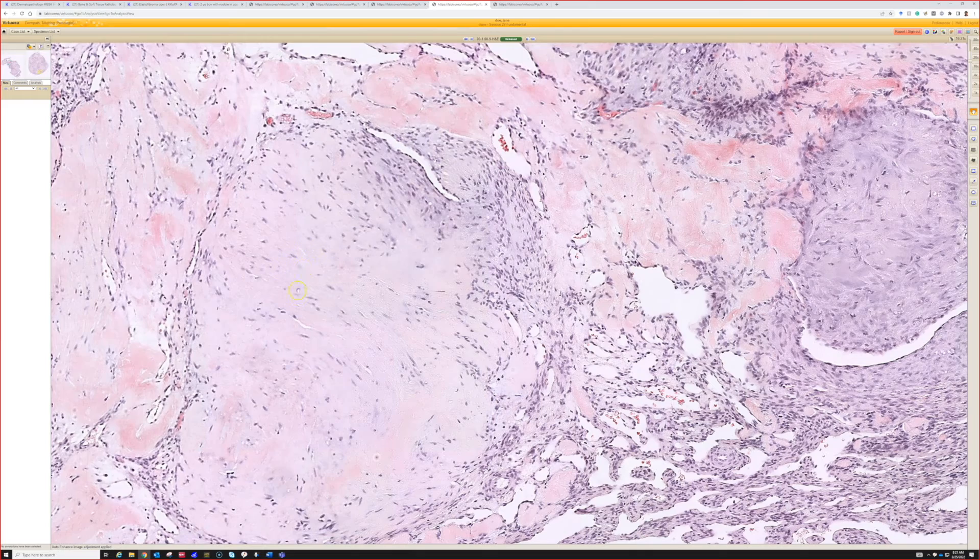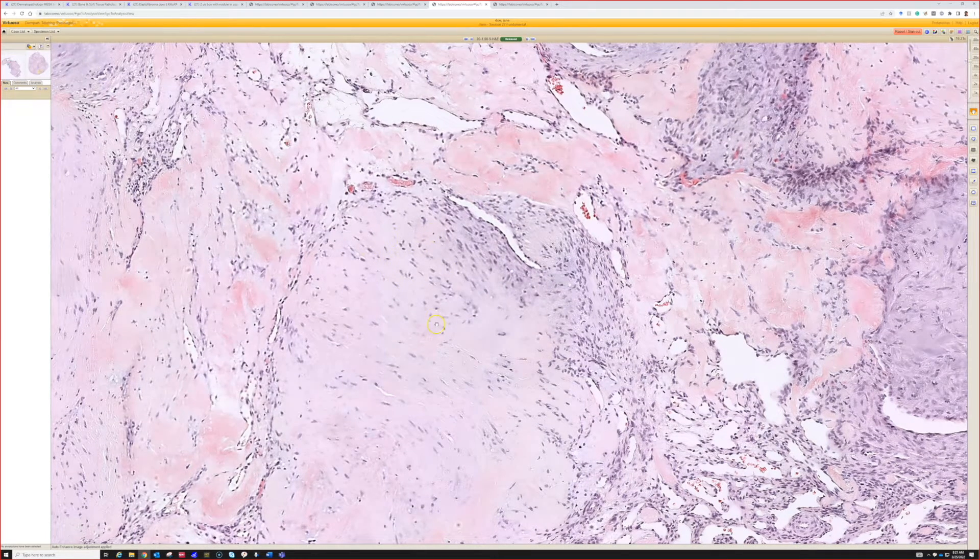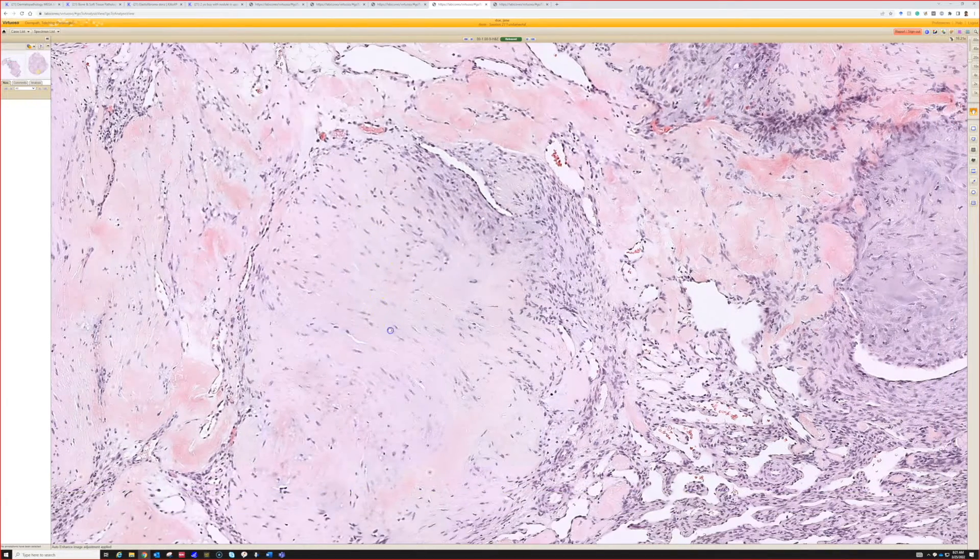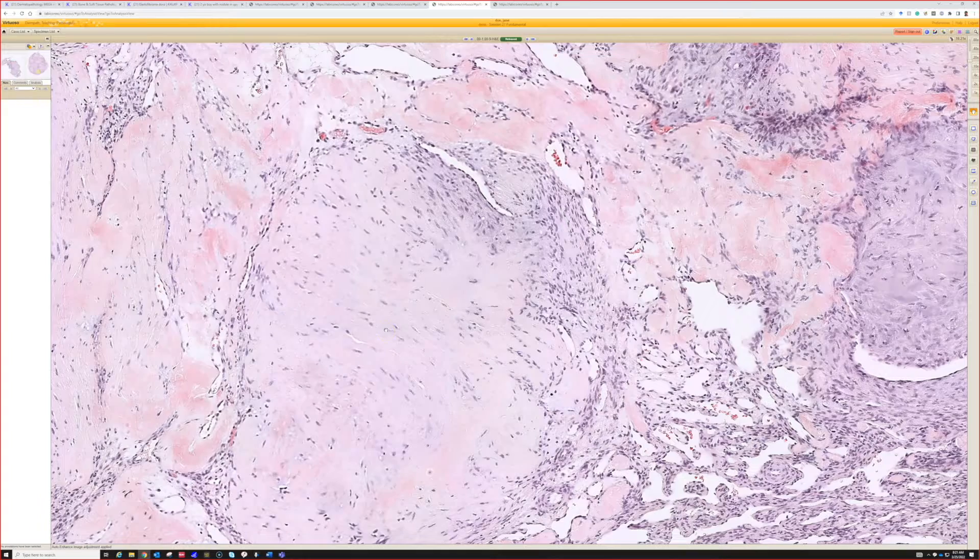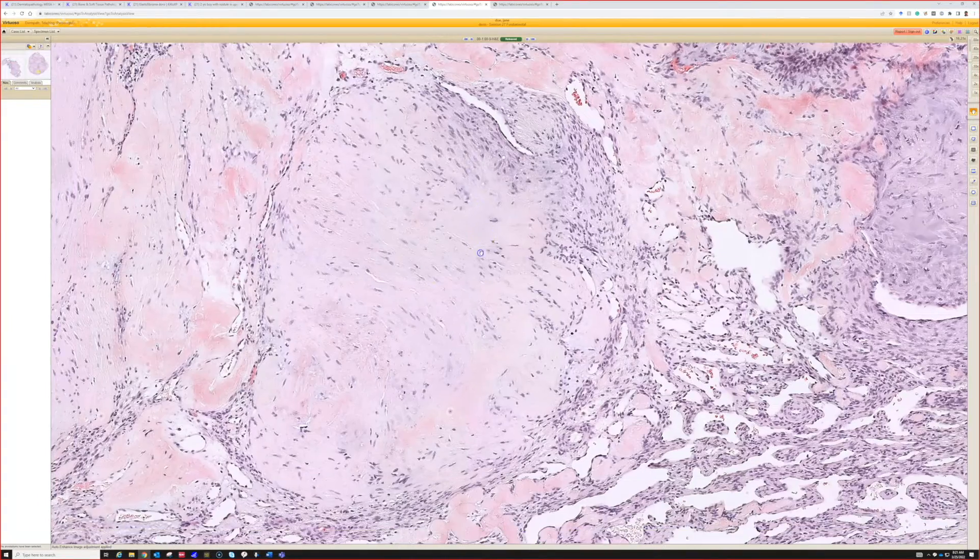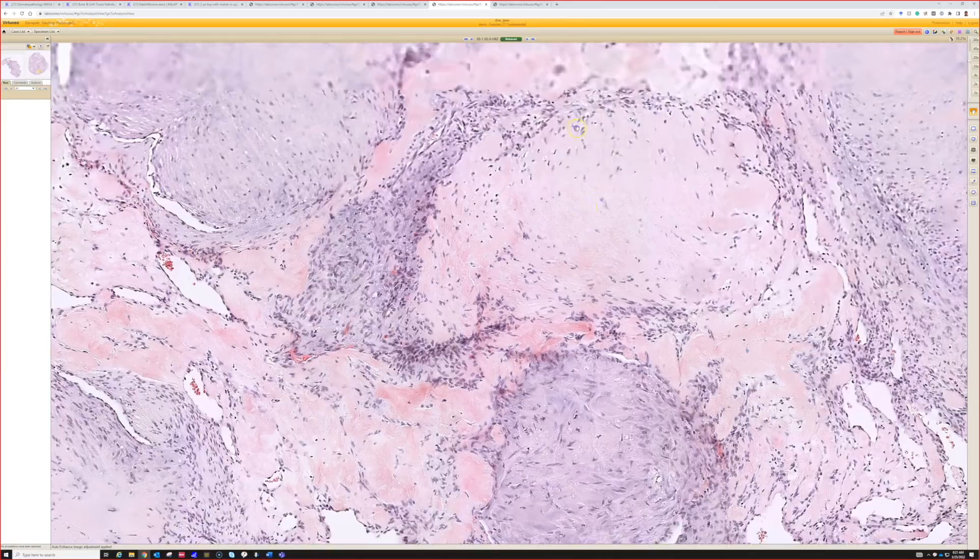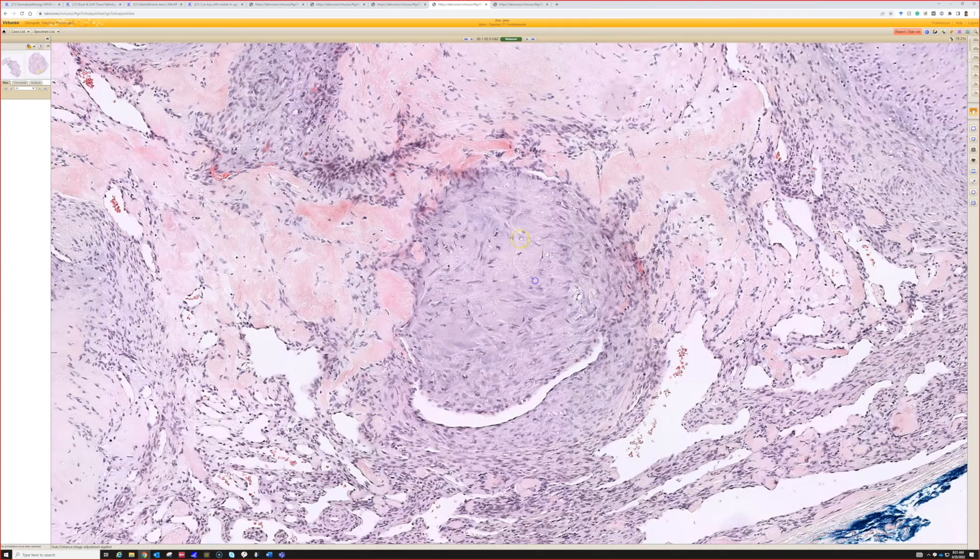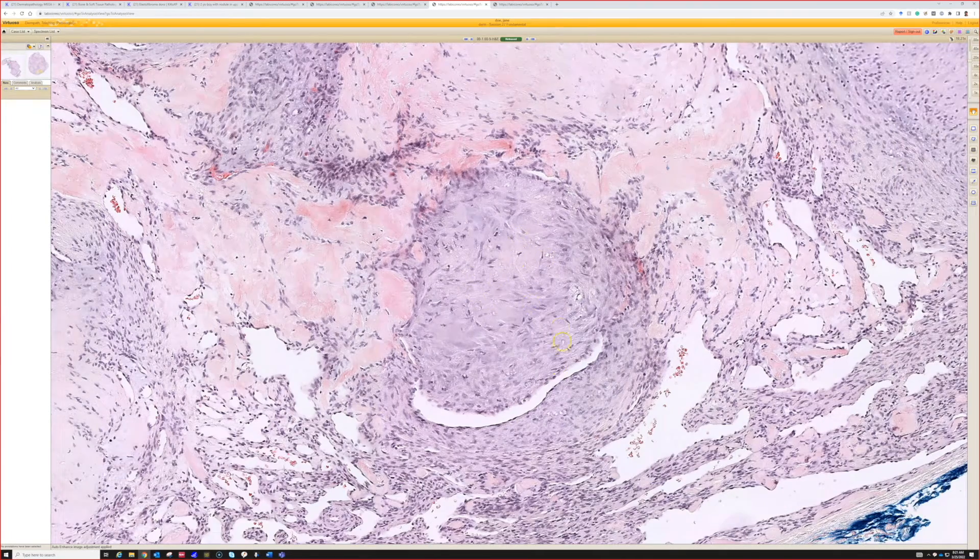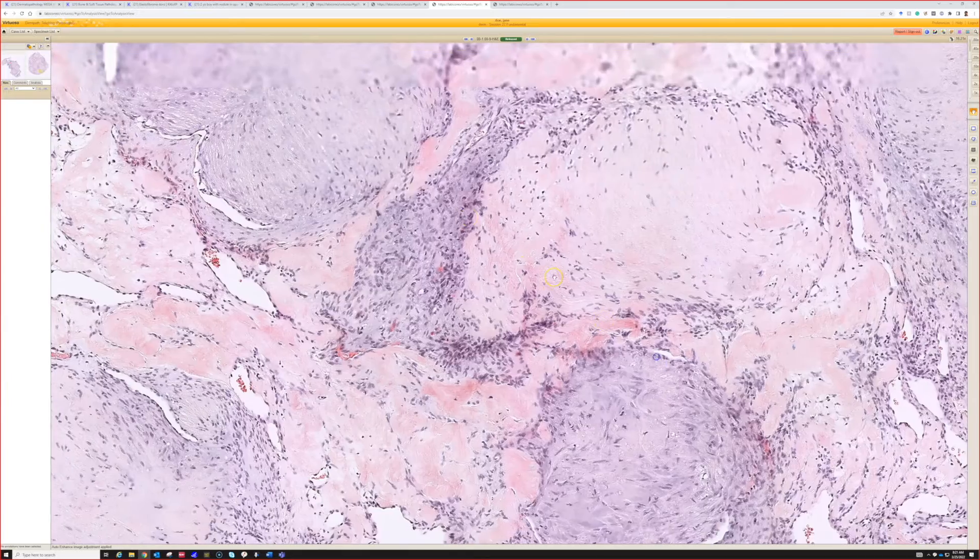Here also bland spindle to oval cells, although much less cellularity, and they have that background that's kind of a pinkish blue color. In some places you see cells kind of pushing into vessels - see how it's bulging into the lumen of a vessel? That's a useful little clue.